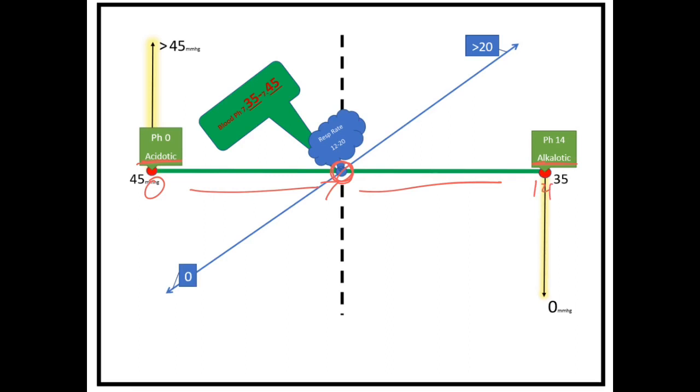Now I would like you to imagine that we also put on this scale the respiratory rate, and that all of these were mathematically figured up, and that's why all these lines are where they are. But this is just a simple diagram to help you understand better. So what's our normal respiratory rate?